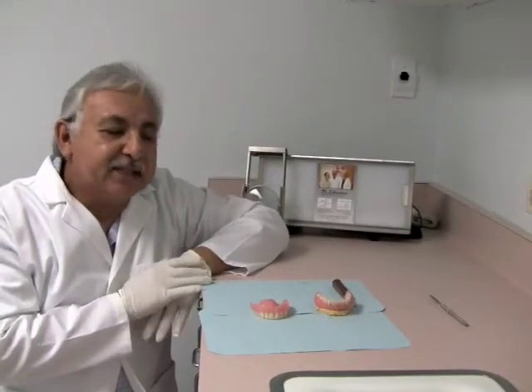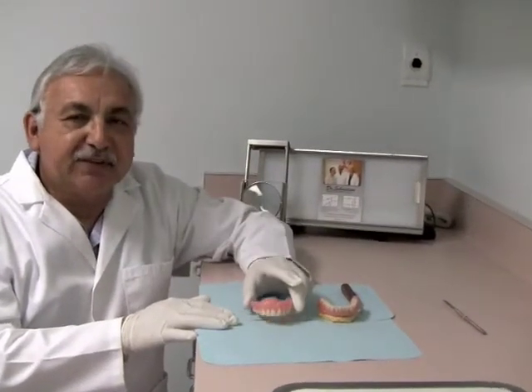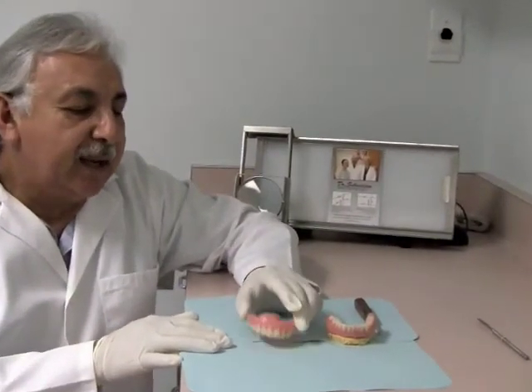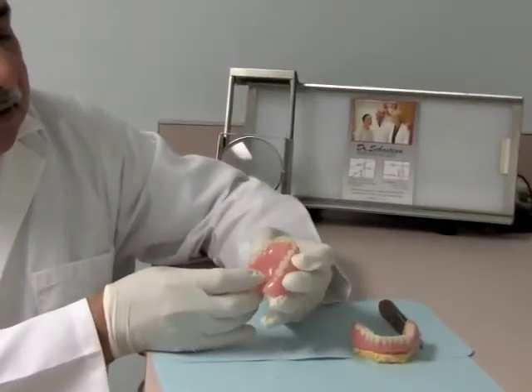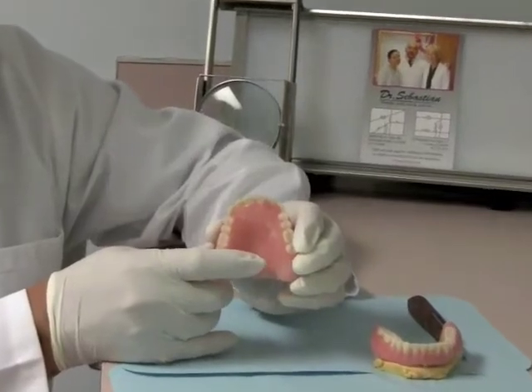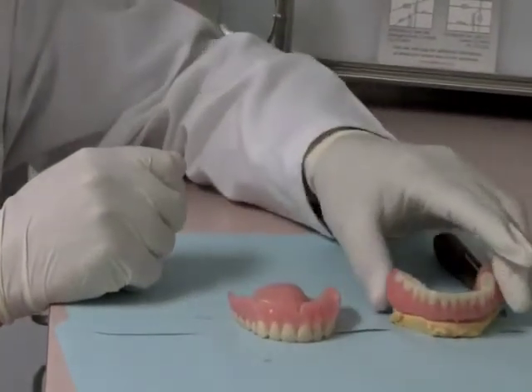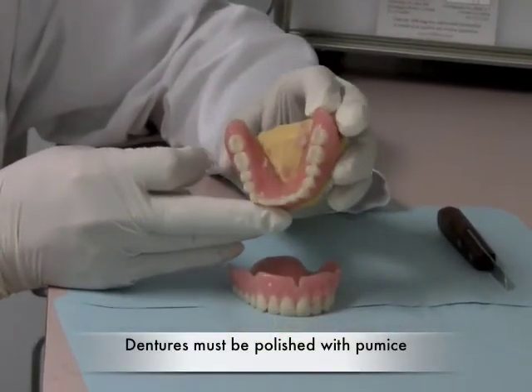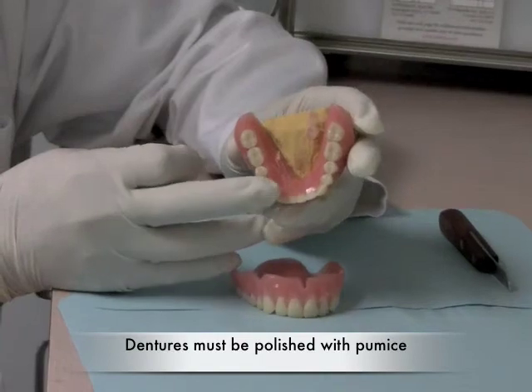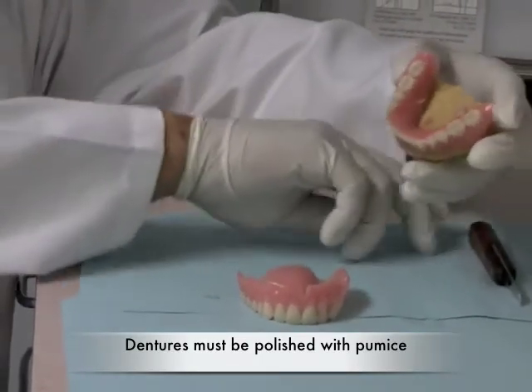Okay, so the next thing I wanted to show you, this next step, is that my material has been sitting for at least 20 minutes, and now this is really hard and really rough. I don't know if you can see how rough this denture is. This is pretty rough right here, and also this repair is really rough, and it's rough on the inside too, with a lot of excess because the material had to flow in all the little cracks.